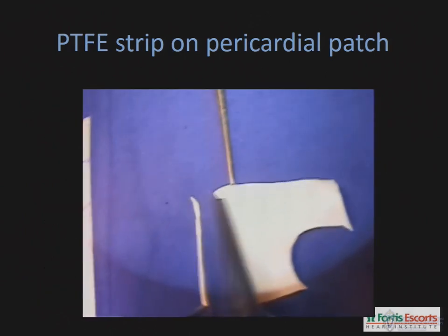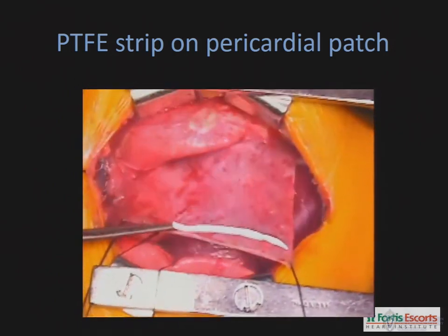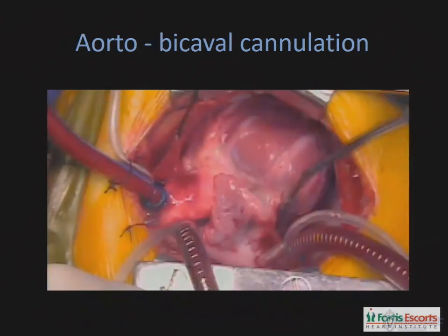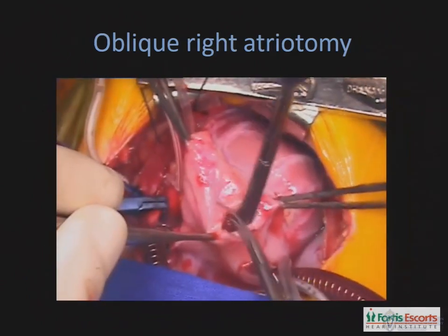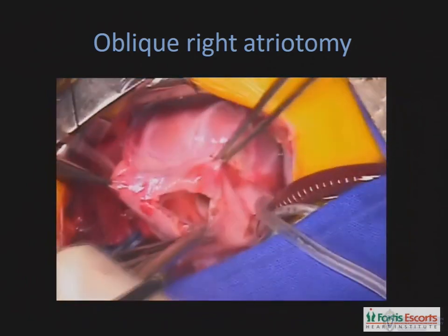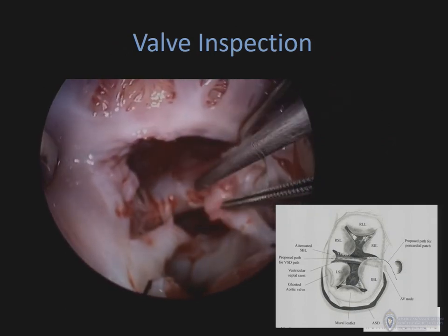To start off with, we take a small strip of PTFE and attach it to one side of a rectangular piece of pericardium that forms the pericardial patch for the ASD. Cardiopulmonary bypass is instituted using a single aortic cannula and bicaval cannulation. Exposure is achieved through an oblique right atriotomy parallel to the AV groove.